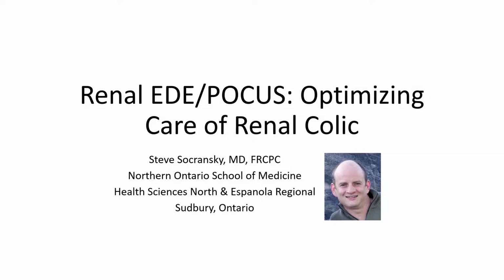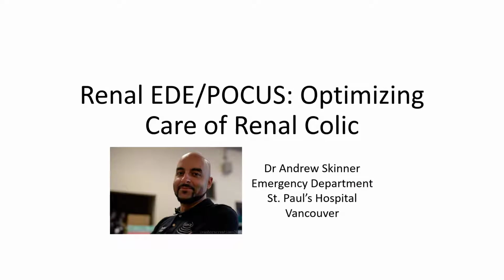I'm going to be speaking to you today about how you can use Renal EDE or POCUS to optimize care of the renal colic patient. Many thanks to Andrew Skinner, who created the Renal EDE chapter and module from EDE 2. Andrew is responsible for launching the POCUS programs at St. Paul's in Vancouver, and he's also an excellent barber.